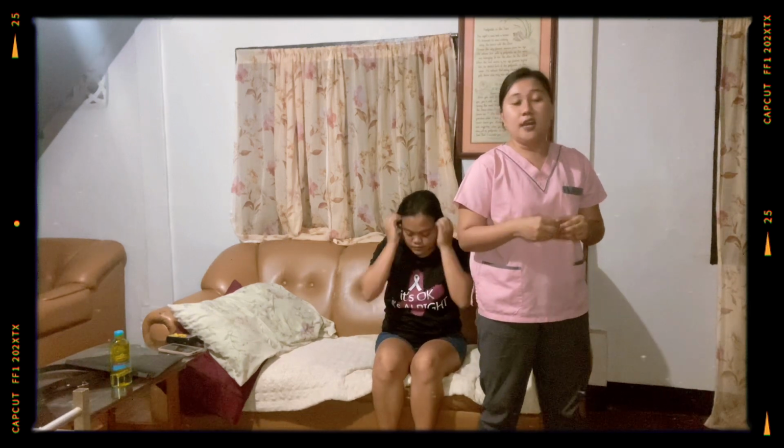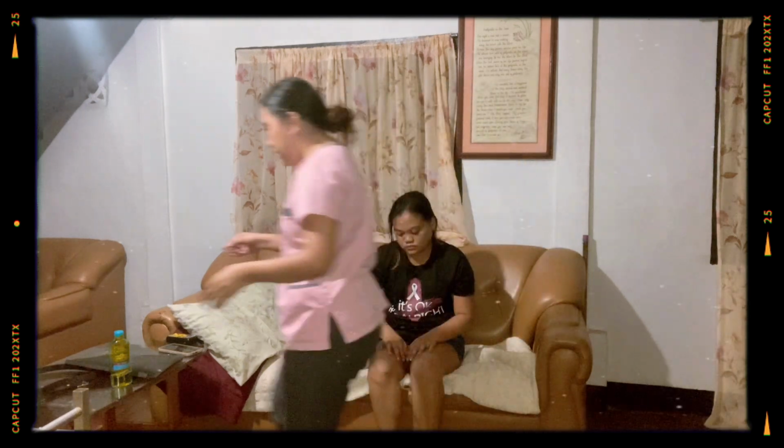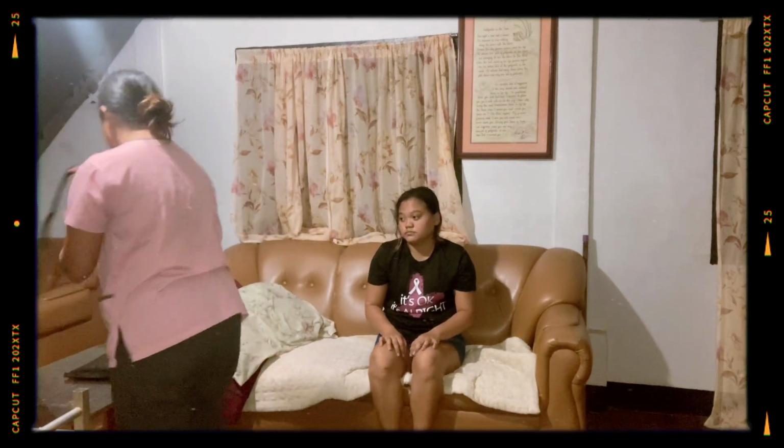So now we are going to proceed to the next procedure. For procedure number 5, wrap the gait belt around the patient's waist based on assessed needs and facility policy. This gives the patient a greater feeling of security. So, ma'am, I will put on the gait belt, okay? Can you do it?